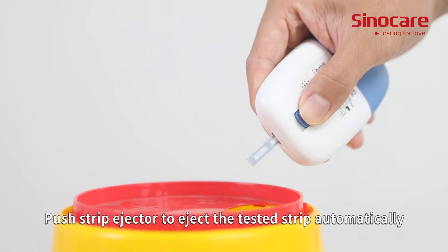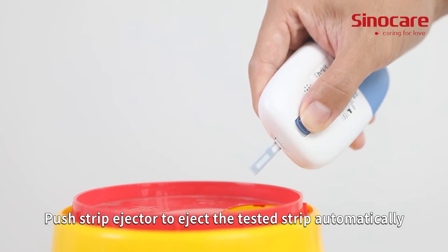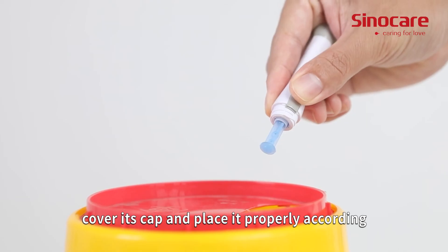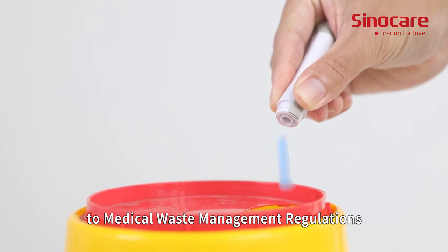Push the strip ejector to eject the tested strip automatically. Twist off the lancet, cover its cap, and place it properly according to medical waste management regulations.